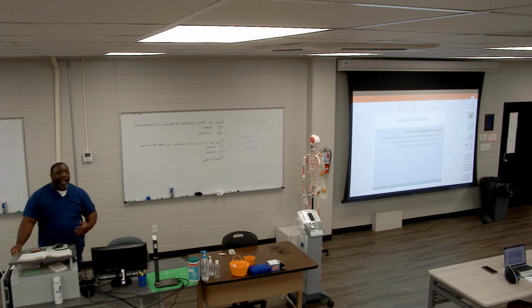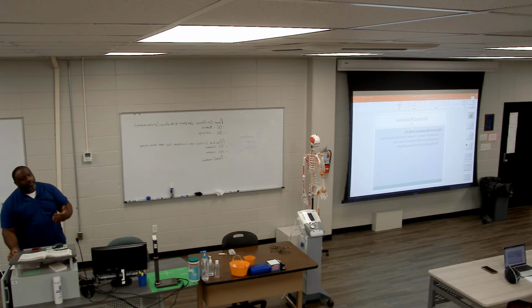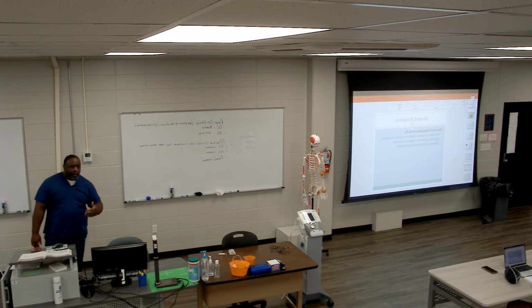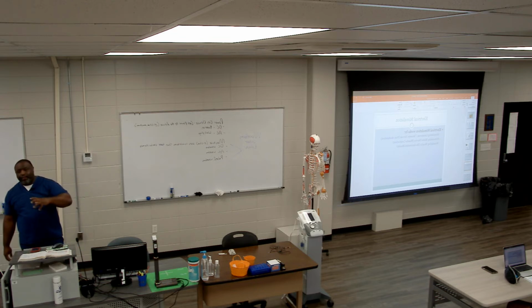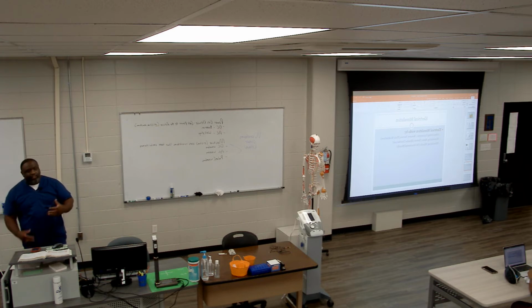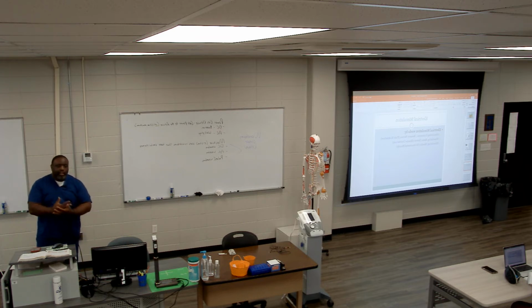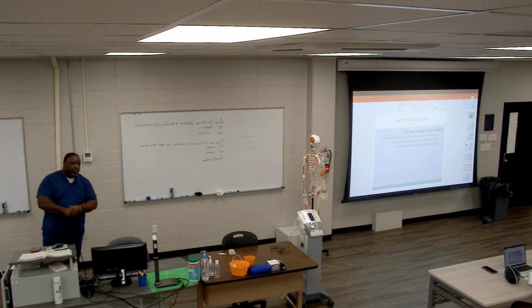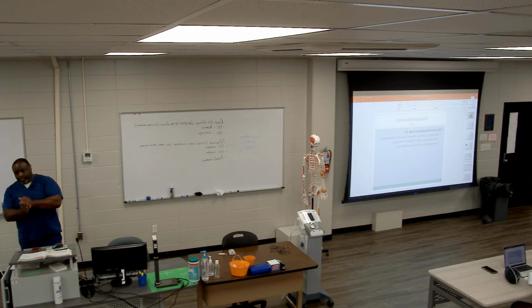Okay, so how does E-Stim work? There are 3 different functions that we are trying to produce as it relates to electrical stimulation in a patient. 3 different things we're trying to produce.